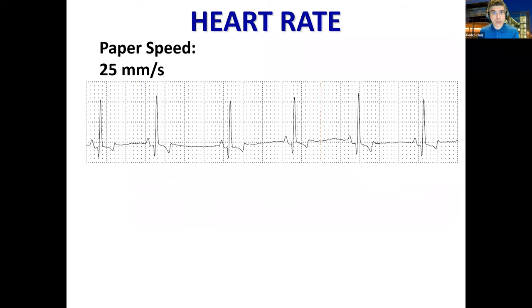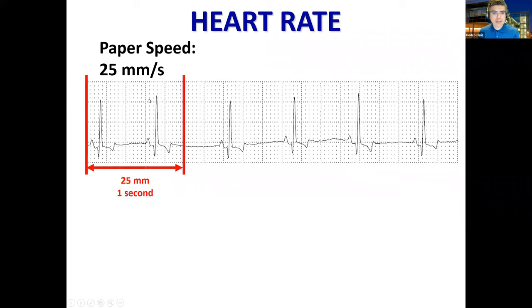Let's take a closer look at this specific trace. If the speed is 25 millimeters per second and every little square is 1 millimeter, then counting 25 of those tiny ones gives you 1 second. To make it easier, you can count in bunches of 5: 5, 10, 15, 20, 25 little boxes — so in 25 little boxes, or 25 millimeters, you have 1 second.